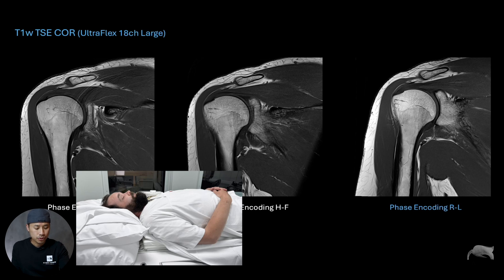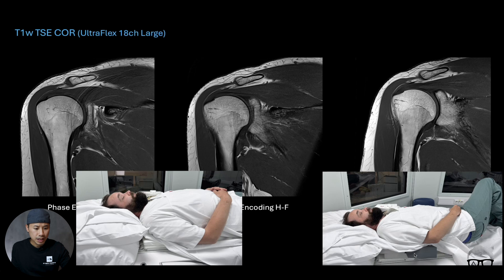The next thing I'll show you is that in this image we are putting some cushion behind the patient, so the patient is not lying straight — they're lying a little bit oblique. There are two benefits to this: first, the patient slides toward the coil even more, so the shoulder is closer to the coil. Second, lifting the thorax slightly with a soft cushion makes breathing much easier — it's not that heavy breathing which causes artifacts. Also remember to consider the hand extension because of the supraspinatus anatomy.